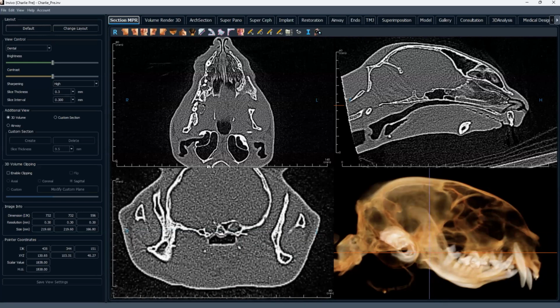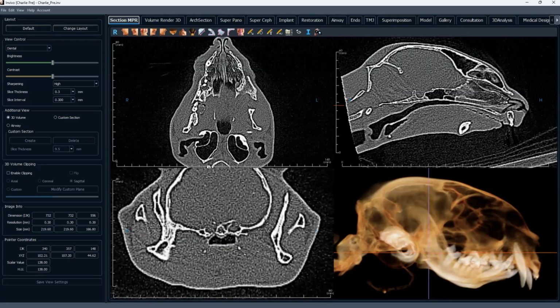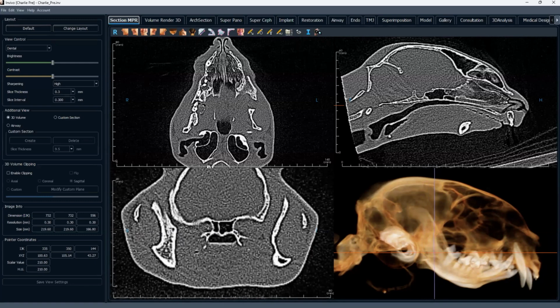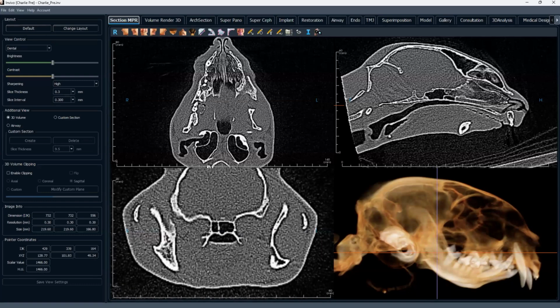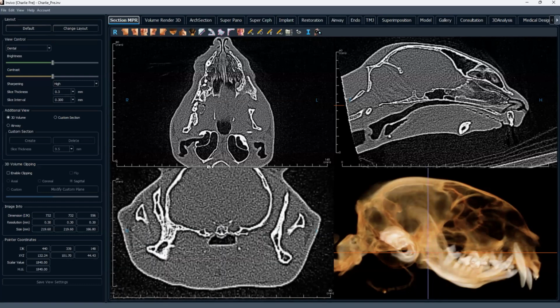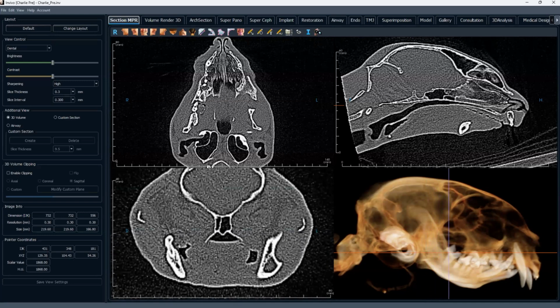As we go back, we should start to see the opening of the inferior alveolar, which we'll see on the other side. It should be back here. Actually, right there. So that's where the artery goes into the mandible on the normal side. And on this side, we just have a lot of bone. You can see the beginning of it, but then it sort of peters out. So it looks like we probably don't have a patent mandibular artery behind the molar here.